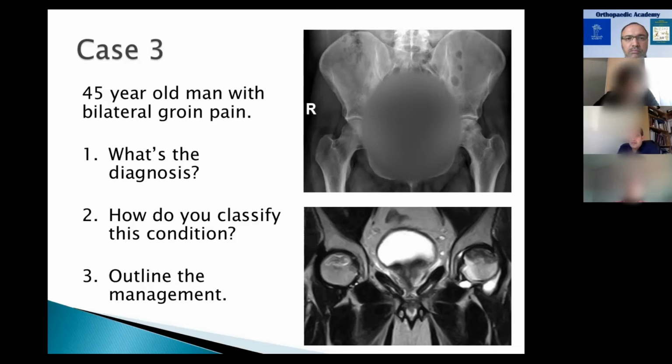Tell me about the MRI. So on the MRI on the left side, I could see that on the superolateral aspect of the femoral head, there is decreased signal intensity, and apart from that, most probably there is a line going there showing subchondral collapse.